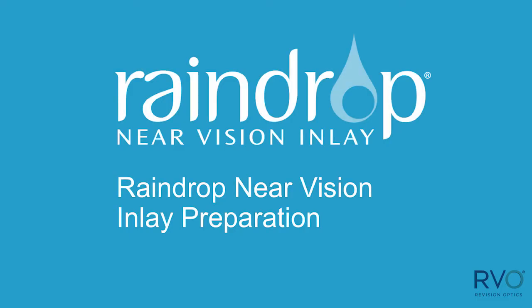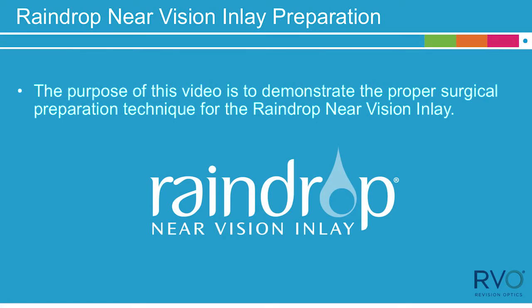The purpose of this video is to demonstrate the proper surgical preparation technique for the Raindrop Near Vision Inlay.